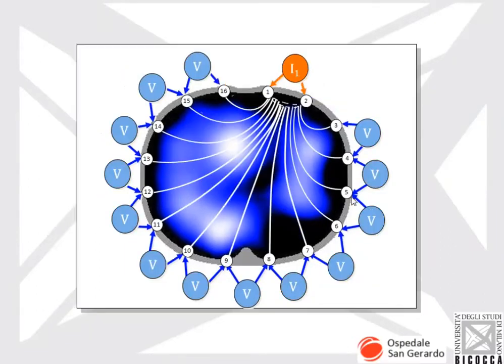And then the injection point is moved, and again this operation is performed. I will not show you the whole combination, but this is happening very, very fast, about 20 to 50 times a second. So the rate of acquisition is between 20 and 50 hertz. And this is what you get.